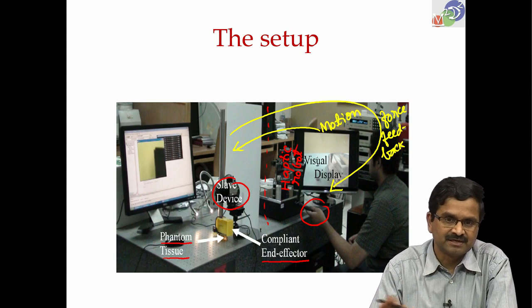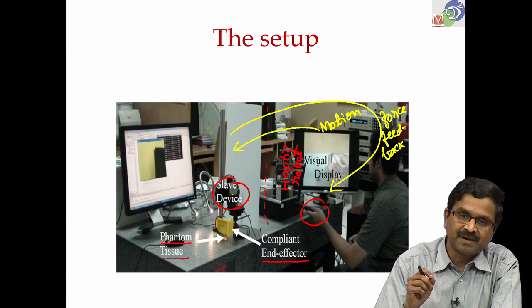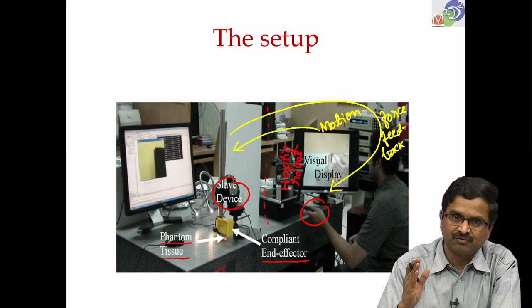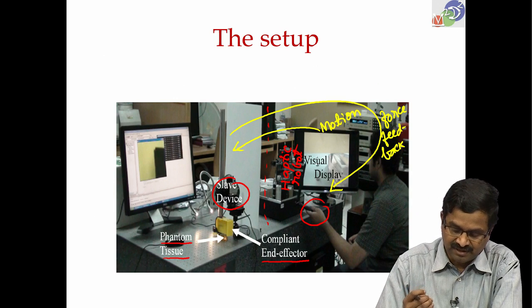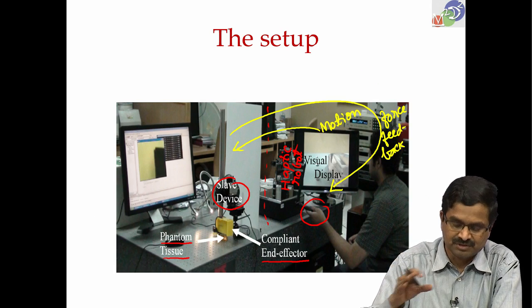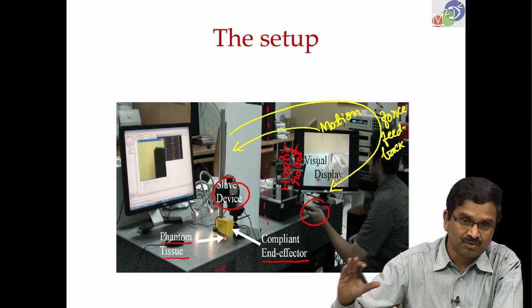That is normally done, that is not anything new. What is new in what I am going to talk about is that this cutting force is limited passively, not by control, limited passively to a certain value, so that you can cut things that take less than a certain value of force. Other things it just would not cut, it retracts by itself. So, there is a built-in kind of intelligence in the device that will make you safely cut something with only that much force. The device that we have has a cutting force of about 2 newtons. More than that it would not cut, it simply comes back by itself, there is no control.